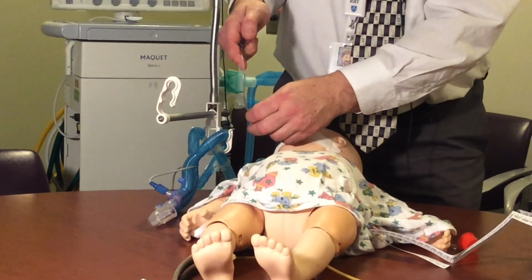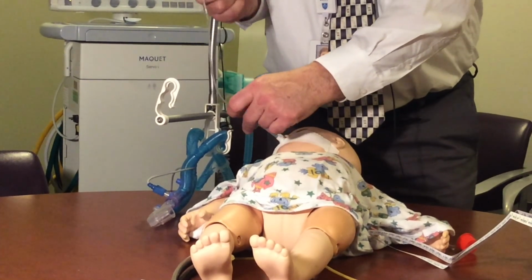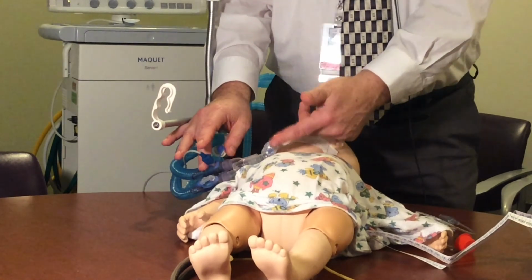Then, as always, apply intermittent suction, rotating the catheter on the way out for no longer than 10 seconds. Reconnect the patient to the ventilator circuit and ensure proper placement of the tubing.